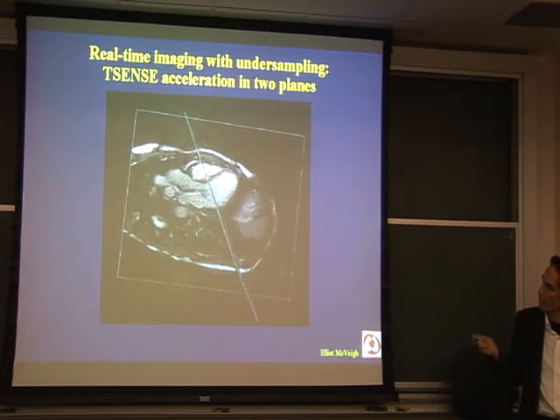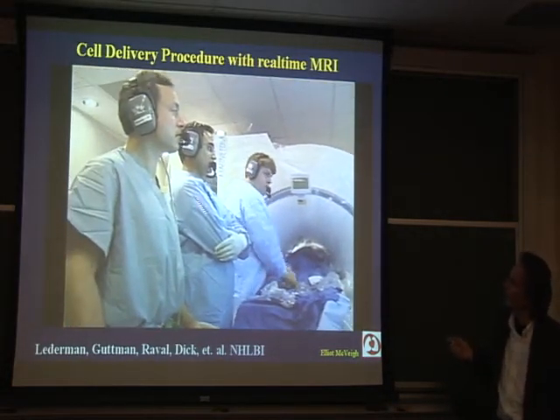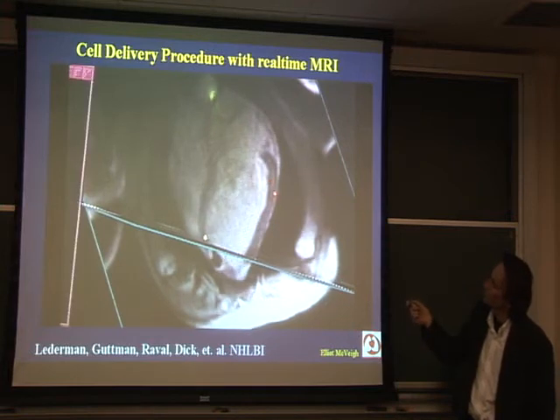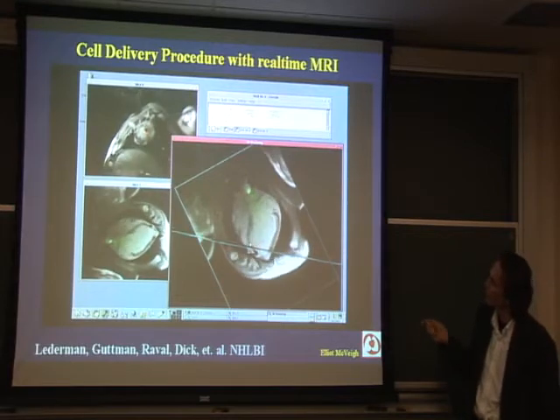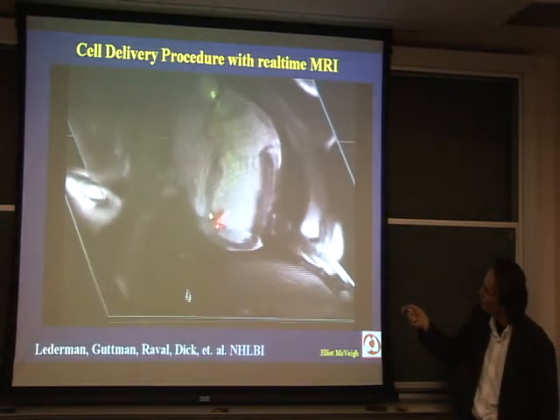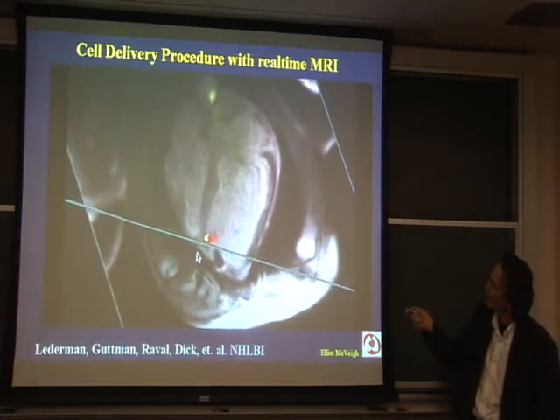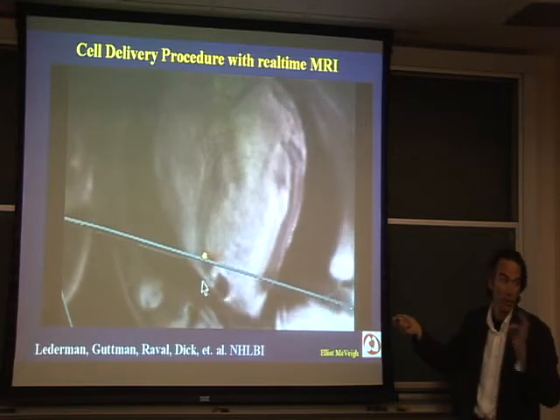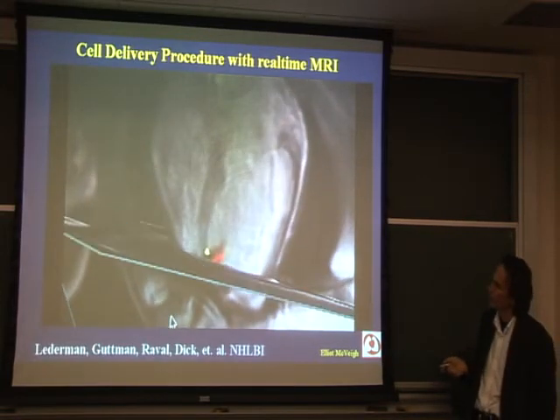So let me turn this frame on again. This is slow because we've got multiple planes running simultaneously. This is known as Sonata. This is the old version. But what you can see is there's the red dot there where the device is, and it's very dramatic. And there's also a yellow dot that might be put on interactively as a target. And that target is visible in 3D when you rotate the plane around and you're trying to manipulate your device to hit the target.